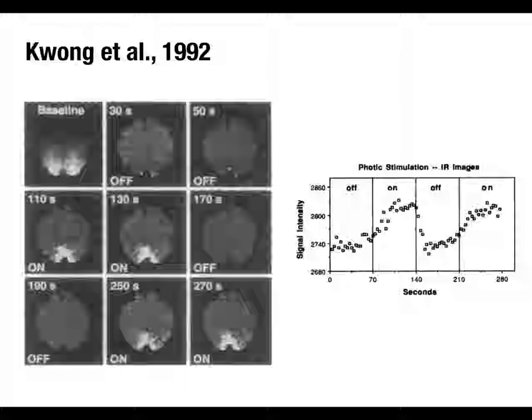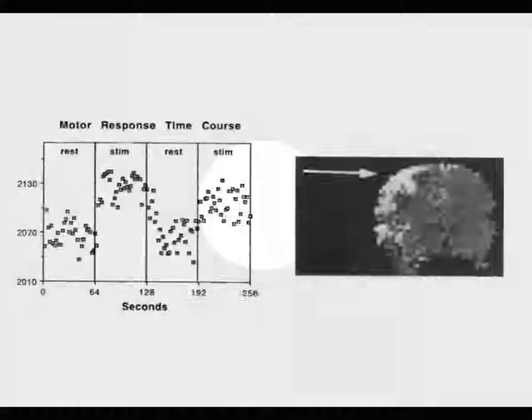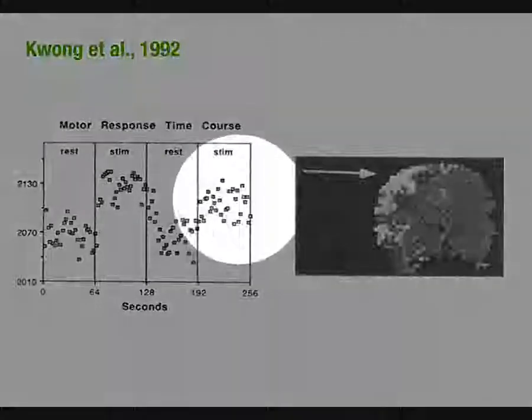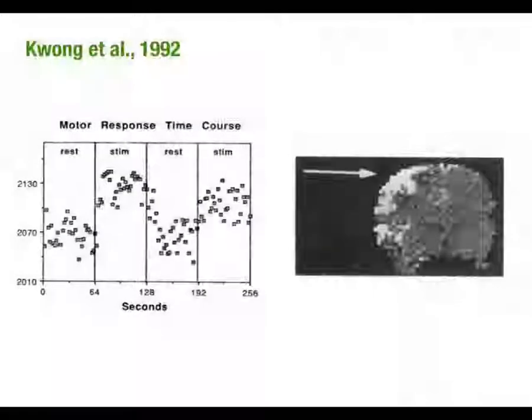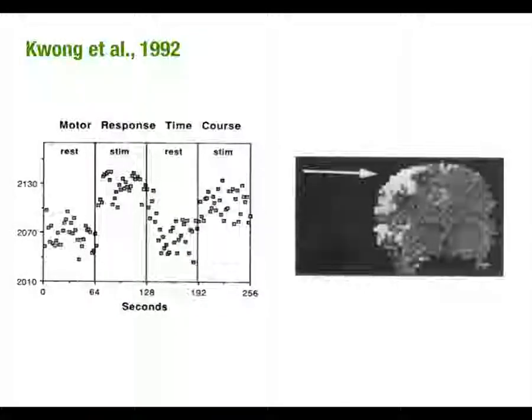Okay, so this was from Quantital. Oh yeah, and here you're just seeing the motor cortex stuff. So this is now a coronal view, like you're looking at the person face on, and you can see one hemisphere is lighting up and not the other because they're just tapping with one finger.